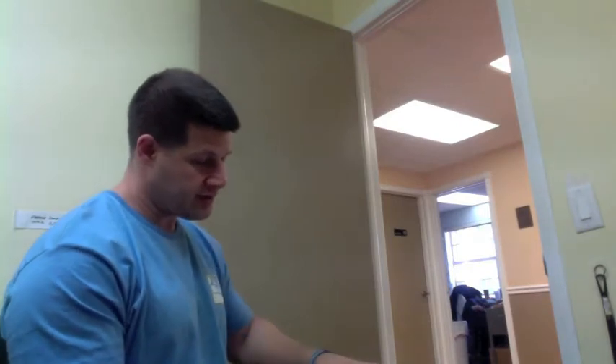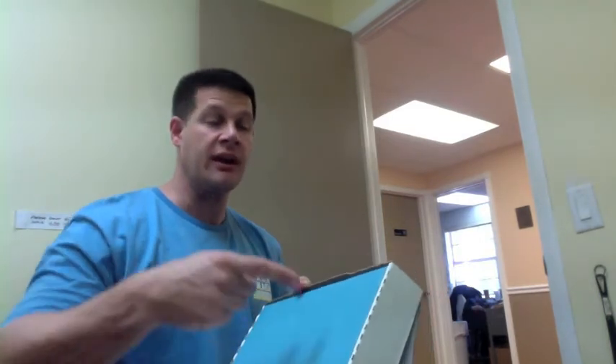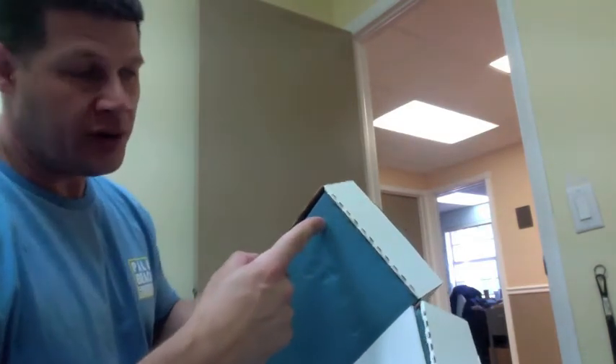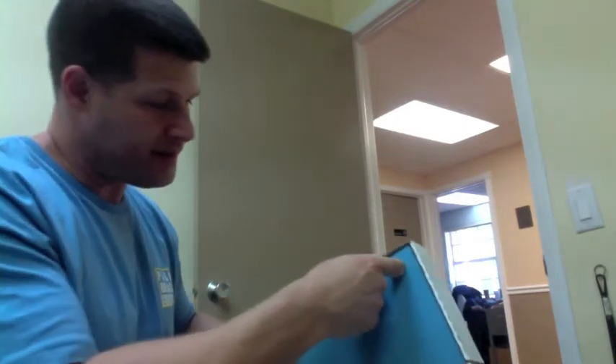Open up the box and you have the foam. When you put your foot on top in just a moment, there's some resistance. I'm putting my hand on and pushing a bit — there's resistance. Sherry has to do the impression to your feet, but if you take your feet and drive it into the foam, you'll see when it's driven in and then you remove it, it leaves an impression.